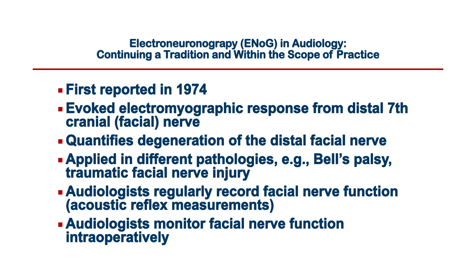Based on ENoG results, the patient may or may not go to surgery. And if you made a mistake, conceivably, and it really could happen, some patients might not make the recovery they should. They may end up with permanent paralysis.